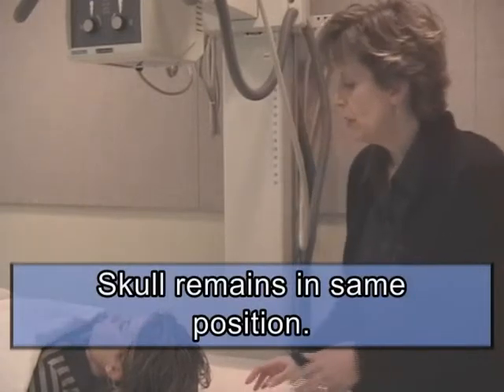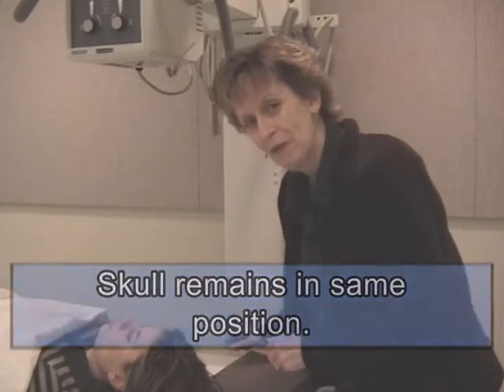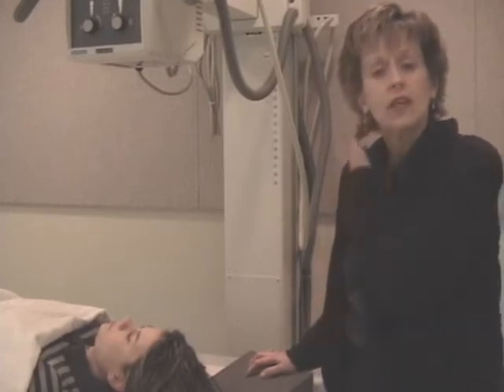I'm going to remove the sponge and just let Drea relax for a second while I change my film, put it back in the exact same position, ID blocker to the bottom, and I'm going to set my tube at a 30-degree caudal tube angle. With a 30-degree caudal tube angle, 5 into 30 is 6, so instead of the gauge saying 40, it's going to say 34 in order to maintain my 40 inches SID.